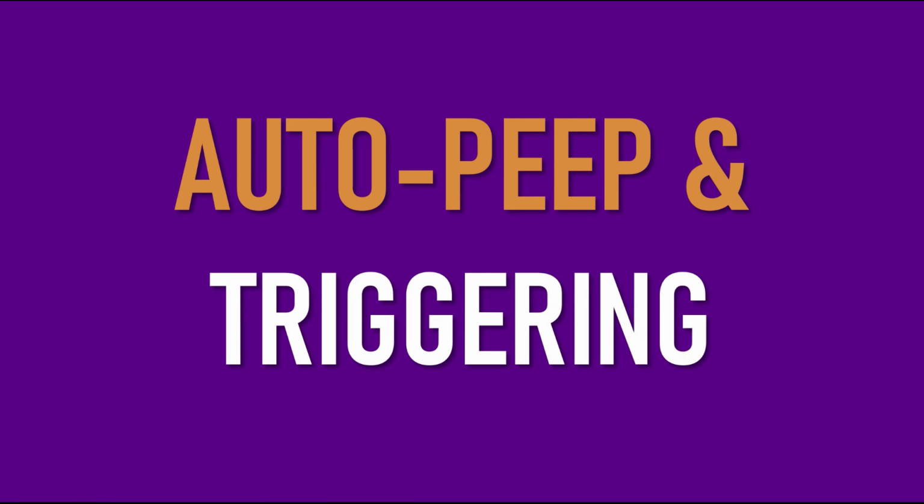You need to understand that the presence of Auto-PEEP makes the mechanism of triggering, whether it's pressure, flow, or Sync, redundant. Because in essence, the patient is unable to move sufficient air despite their having a strong thoracic pump to trigger the ventilator. Let me explain.